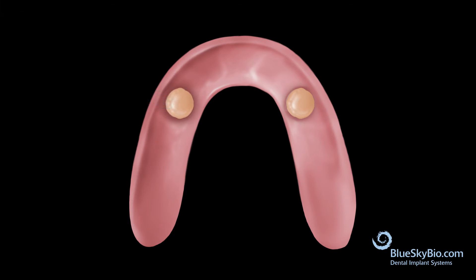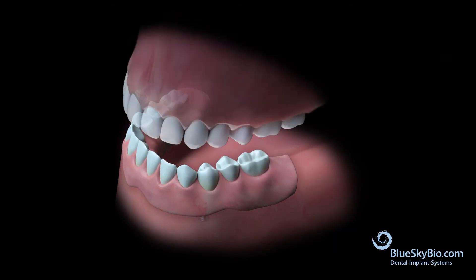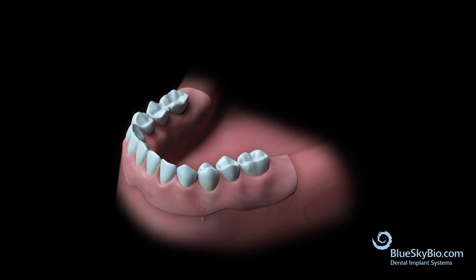Mix the pickup material per manufacturer's instructions and fill the wells. Dry the housings in the mouth and then seat the denture in the mouth. Insert the bite registration and have the patient bite in occlusion gently while the material sets.